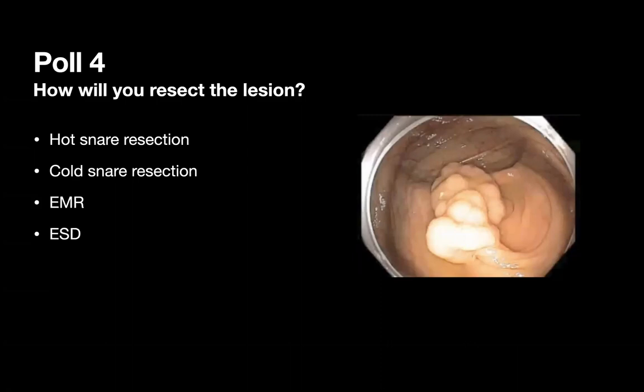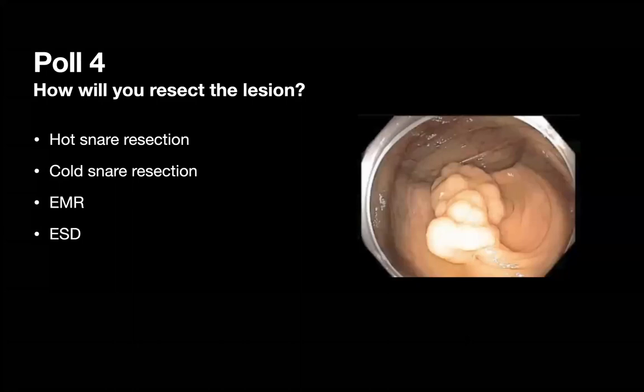Yeah, I go with an open mind, and I echo Sylvia's comments about additional polyps. Personally speaking, anybody who would think that they would remove these polyps, their place and center and the team is pre-equipped to deal with these things even in their busy setting. So I do not see that itself as a limiting factor, but I personally have a habit of partly examining the colon while going in as well, and if I see any polyps which are sub-centimeter, I keep removing them as I go in.